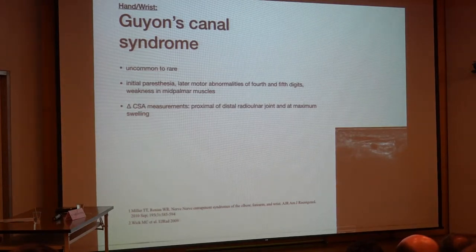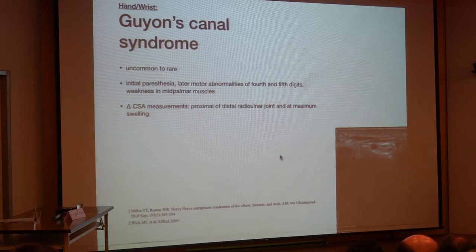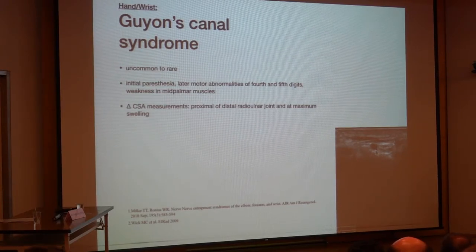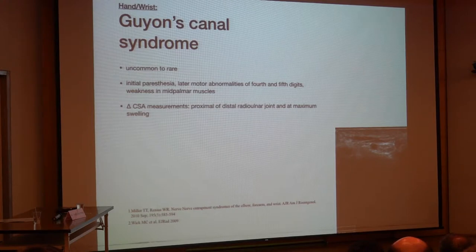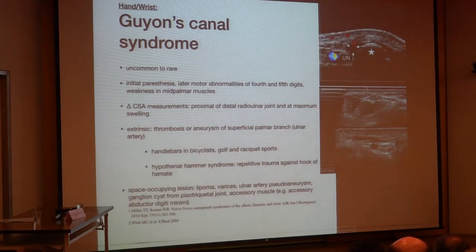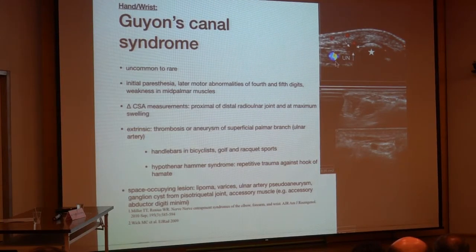Moving to the ulnar nerve at the wrist: entrapment here has been described as uncommon to rare. It presents with typical paresthesia of the fourth and fifth fingers. A delta cross-sectional area measurement is very helpful — we take the maximum CSA at the Guyon's Canal, which here shows 9 mm², and compare it to a more proximal measurement of 5 mm², so it is quite doubled in thickness. Close to the pisiform, we can see a ganglion compressing the ulnar nerve close to the ulnar artery.